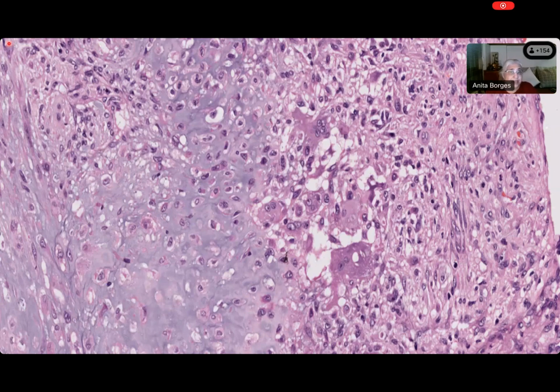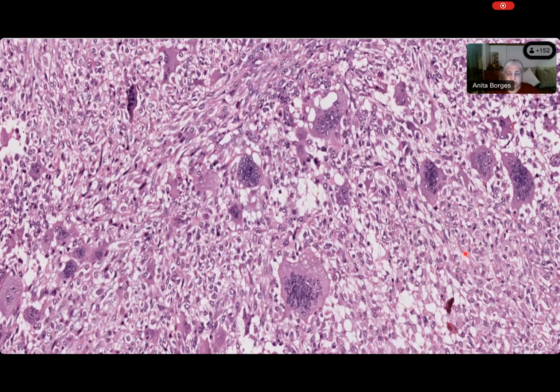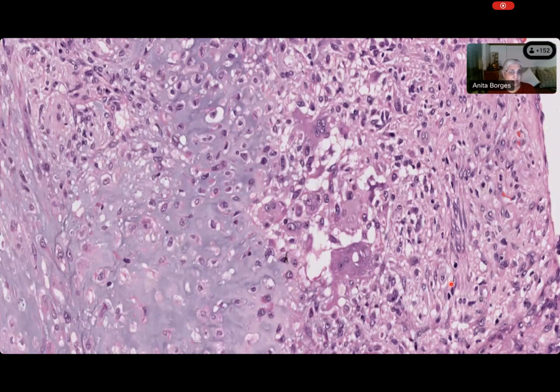It is not. In fact, it has so much variation that it is beginning to resemble the variation you're seeing outside of this cartilaginous area. In the previous area, you saw more or less monomorphic looking cells. There was not much variation. We said that about the stromal cells, but now comes the cartilage, and there is huge cellular variation. You're beginning to see the so-called stromal cells, which are associated with these osteoclastic cells, which are also varying.